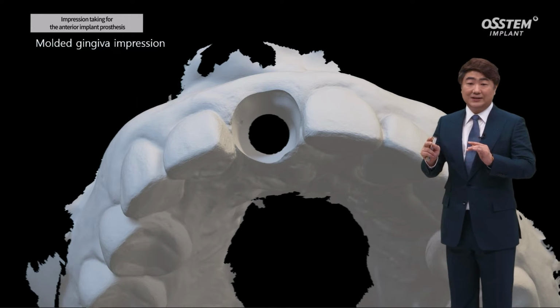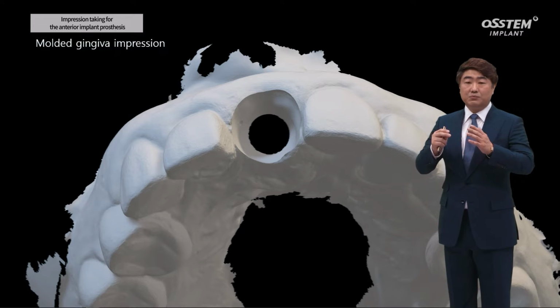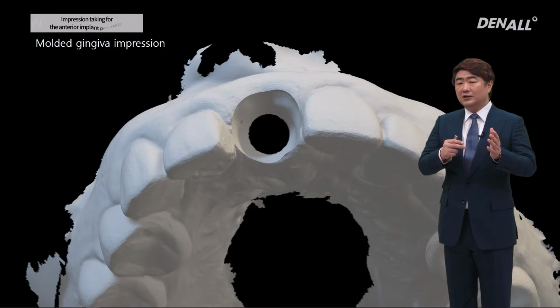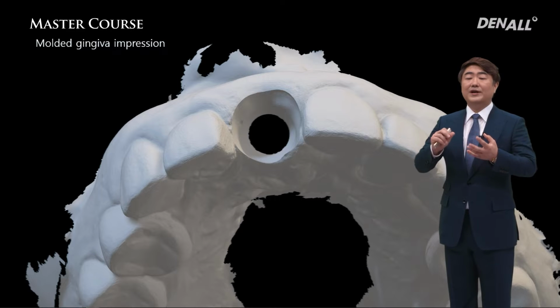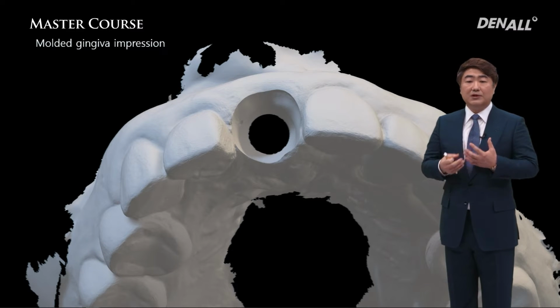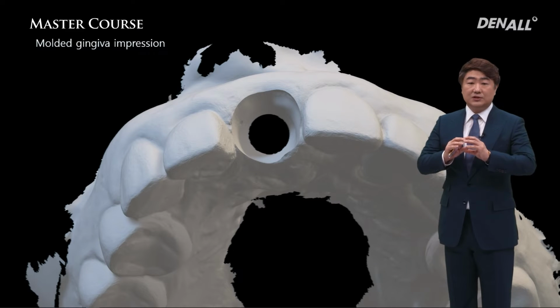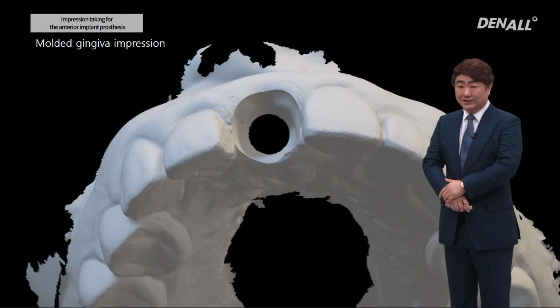When we create the final abutment, the running room area's shape and form is different from the temporary. The gingiva shape could change, and it could also change after the final is delivered. So you need sufficient time for gingiva molding. Once the gingiva is stabilized, that temporary running room form needs to be referenced in creating the final abutment.